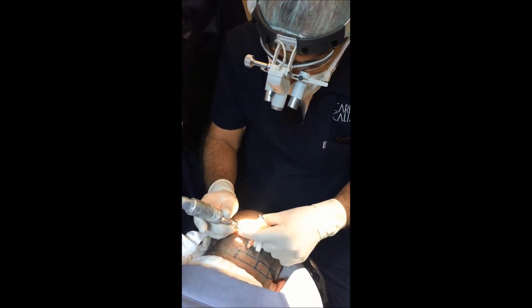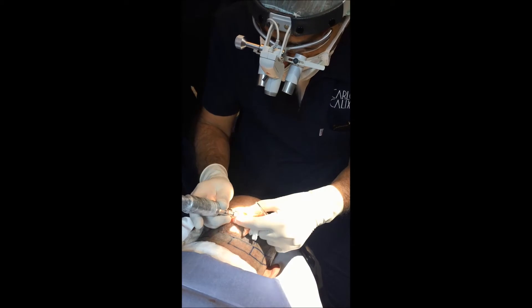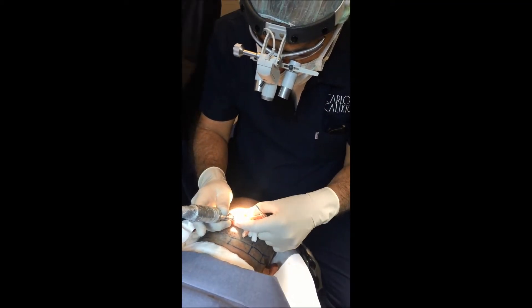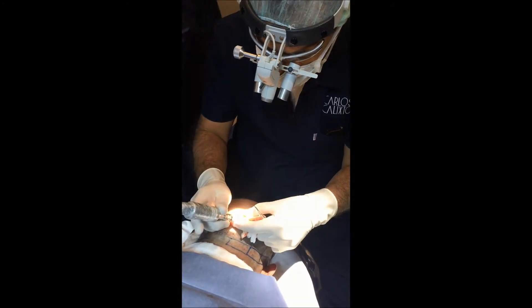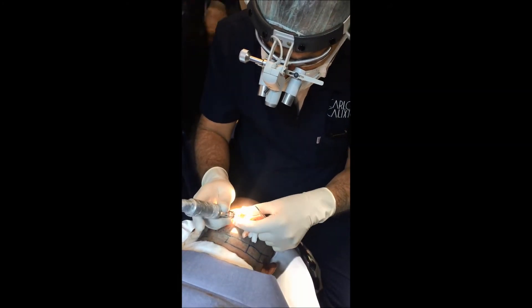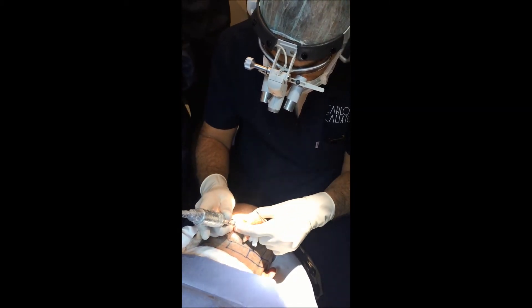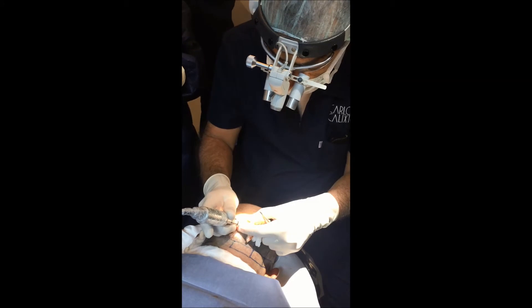For the beginner, is there more risk of transection with a machine? No, it doesn't matter. I feel comfortable to begin. At the beginning, I went safe and I started surgery. I used the manual and I removed around 100.